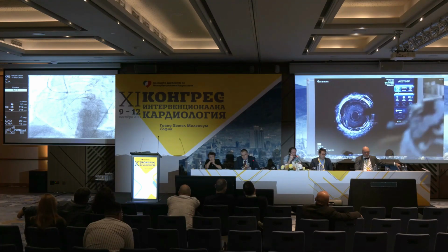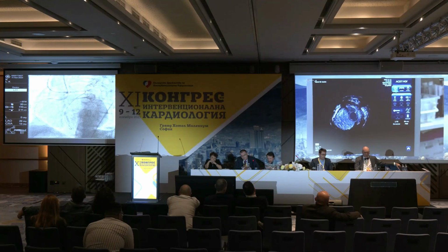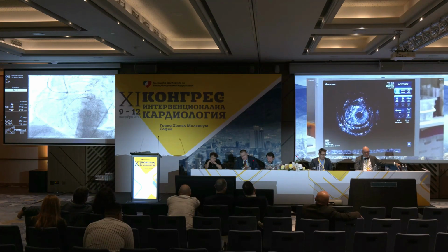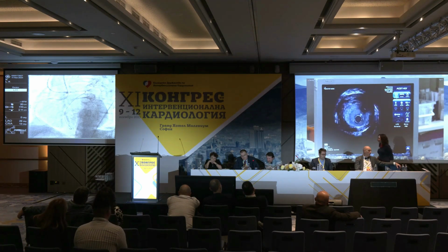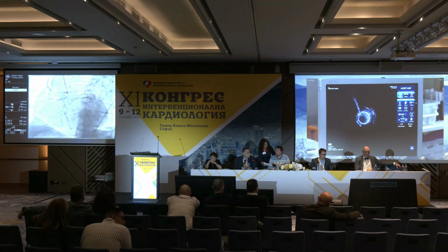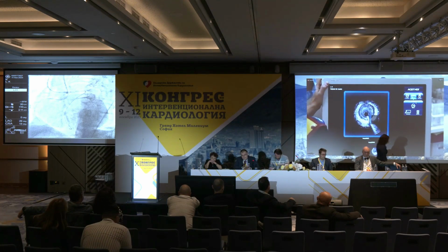Yes. Okay, the vessel is enormous, as you can appreciate. Now we're in the occlusive part, and you see the hematoma from the antegrade at 3 o'clock. We're completely true to true. The vessel proximally is around 4.5 to 5 millimeters. What I'm going to do, let's review this angiogram.